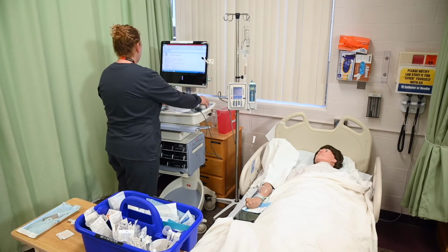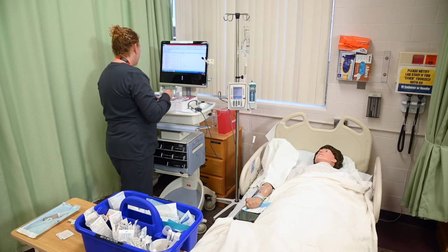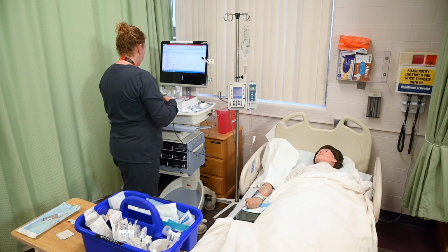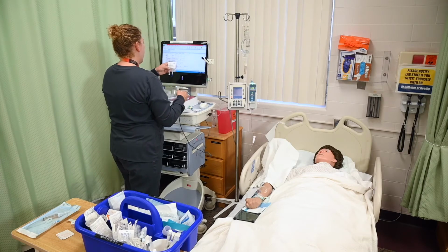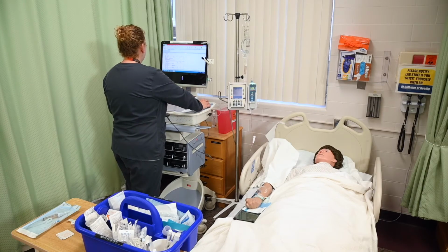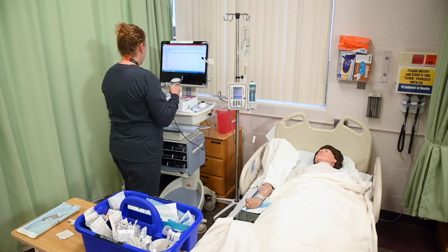IV practice, date of birth 3/3/87. I have ceftriaxone, 1 gram IV Piggyback daily, and the time is now. And I have ceftriaxone, 1 gram, in 0.9 sodium chloride, 50 mLs. IV practice, date of birth 3/3/87. 0.9 sodium chloride, 10 ml IV push, PRN flush.